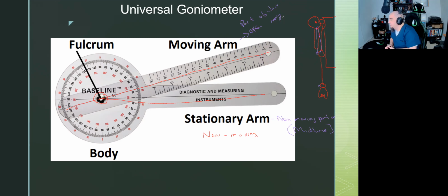So Josh says, can we let the arm be neutral, or does it have to be in anatomical position for shoulder flexion? So we're not going to put it way out here if that's what you're asking. We're going to keep it neutral with the thumb. Most time with shoulder flexion and abduction, we're going to have the thumb up. We're going to do what's called the open can position, where they're holding a can so it doesn't dump out.